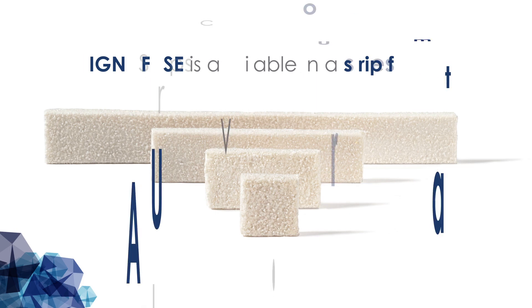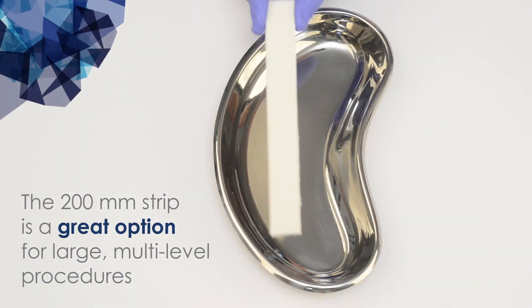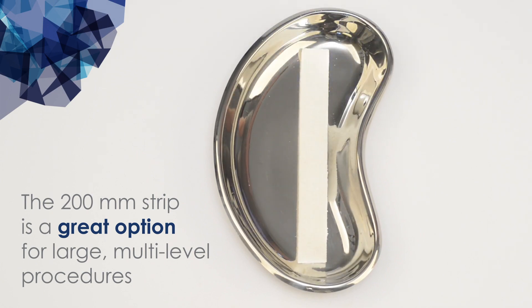The strip format comes in four sizes ranging from 25 to 200 millimeters long. The 200 millimeter strip is a great option for large multi-level procedures.